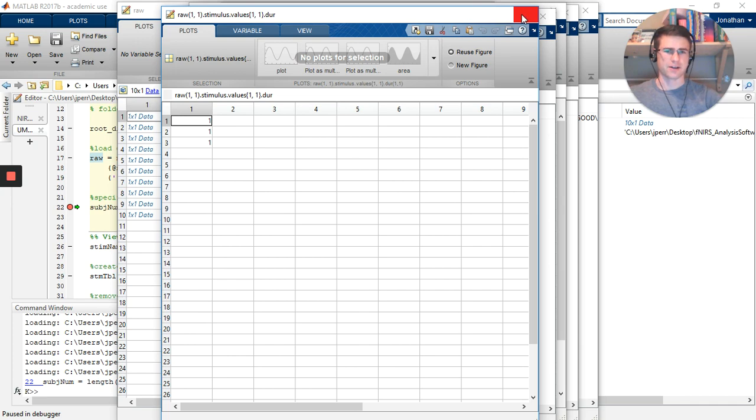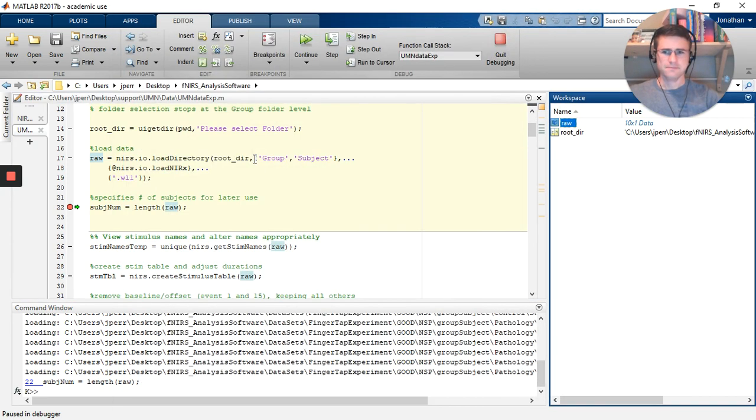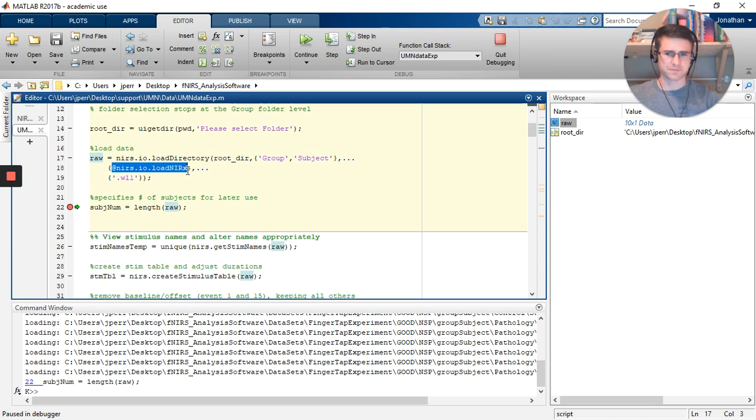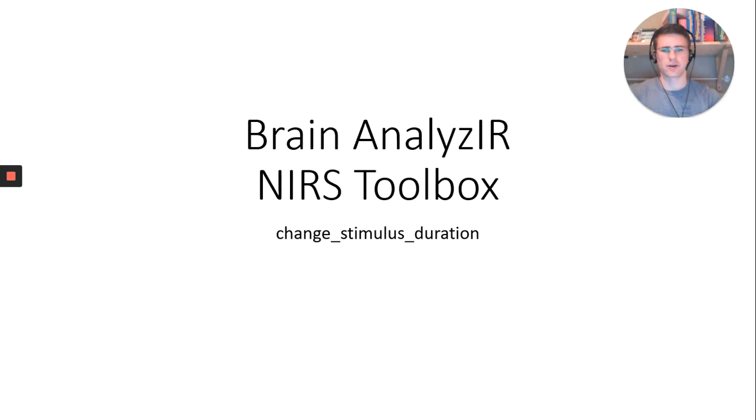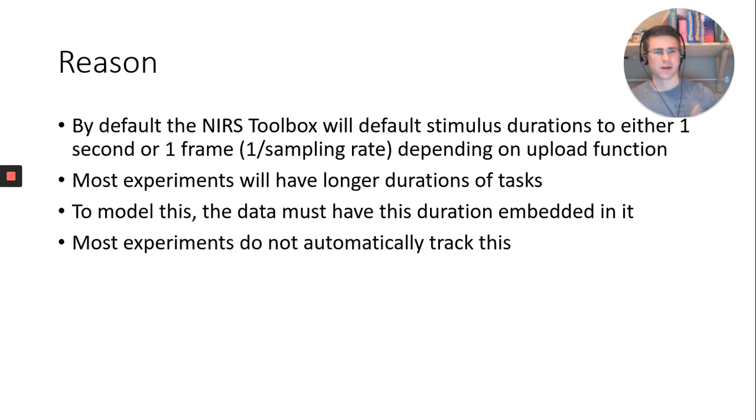The default value when you load it into the NIRS toolbox or Brain Analyzer toolbox is one. I used the loadNerex function. Other functions will have other default values. I think the load.nirs function has the frame length in seconds for the duration. So now you have a quick view of what it looks like. Assuming you have a block average, we're going to move forward with this and go through a default way of how you can do this.